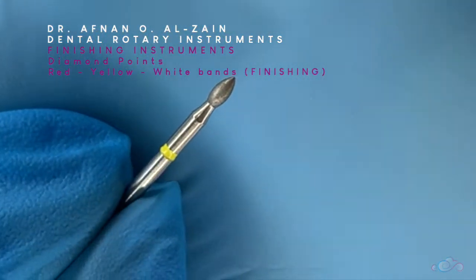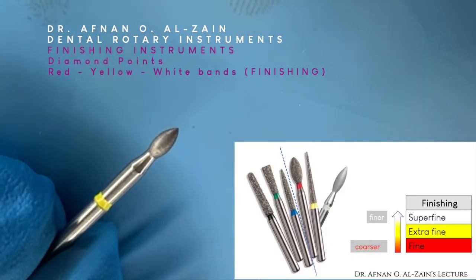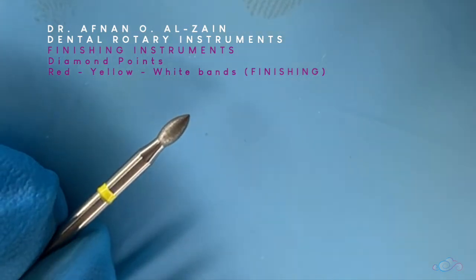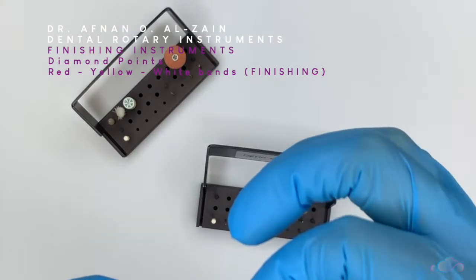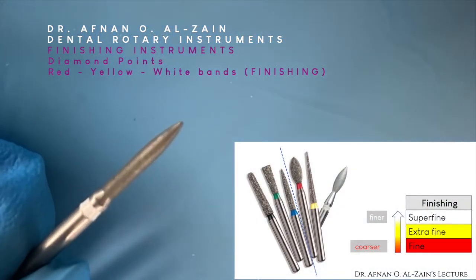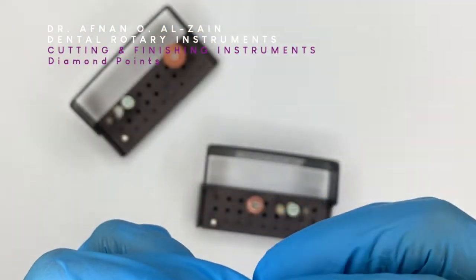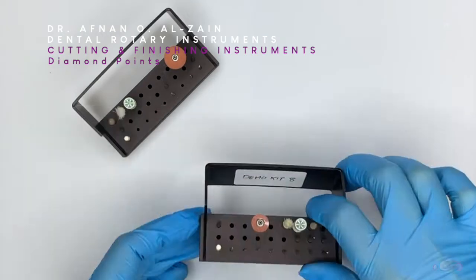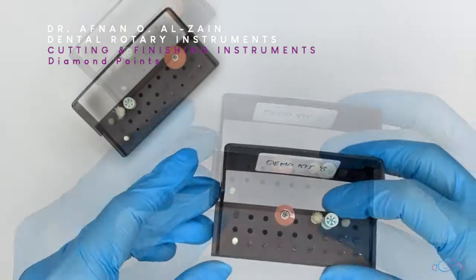This yellow diamond point shape is called short flame or football. We can see that it is a finer grit than the red. The white diamond point is even finer, and this is a flame shape. So the rule is: the lighter the color, the finer the grit; the darker the color, the more coarse the grit. Each color is available in all shapes.